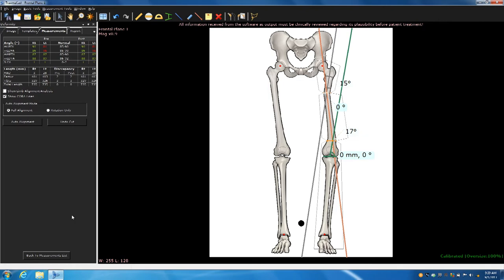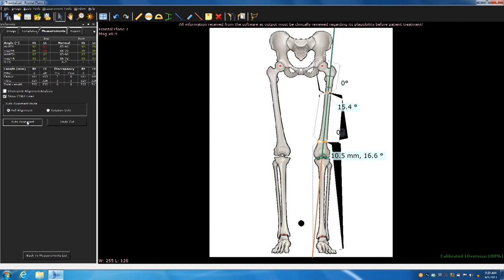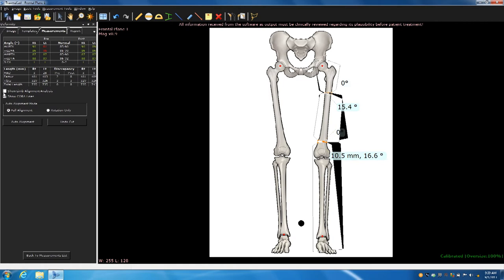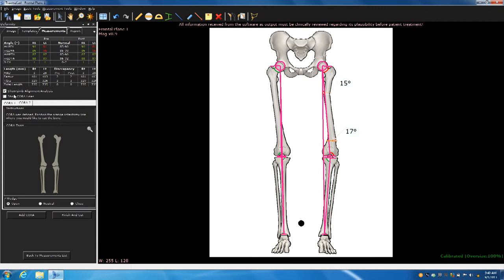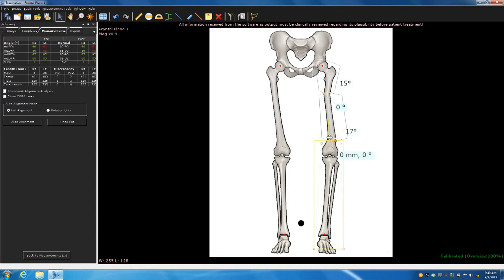Again, you can scroll in. You can adjust this line as much as your OCD-ness wants to. Again, you will see the osteotomy. Now I have to zoom way in. You'll see this little tiny line, we'll see it better on the x-rays, that's the bisector correction line. So if it's a reasonable osteotomy site, keep that there. Again, it automatically chooses an opening wedge osteotomy. You can keep that. You can zoom quickly with the little wheel zooming in and out. You depress your little mouse wheel and you can move around panned. So once you have this deformity, you can see you have a 15-degree deformity approximately, 17-degree deformity distally. And at this point, you hit finish and cut. And automatically, it selects the different regions. It has made two osteotomies where you've designated. And then hit auto-alignment. And voila, you have a straight bone. Now, at this point, you might say, well, I want to see my limb alignment analysis. I know it's given me these numbers post-osteotomy and they look good. So hide your CORA lines and then show your limb alignment lines.